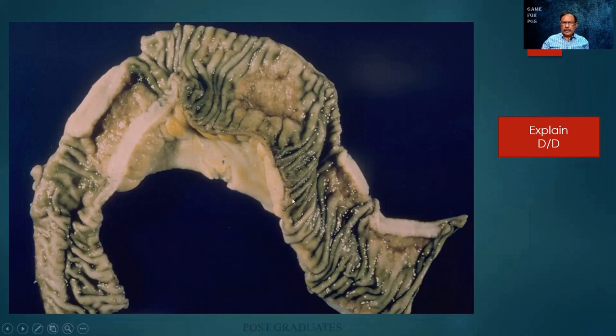And coming to this particular picture, I am seeing an area where there is a loss of the mucosal folds. Loss of the mucosal folds. And it is obviously an ulcer. And the ulcer is superficial. I told you the question can go in any direction.